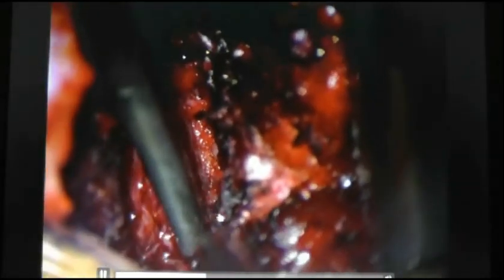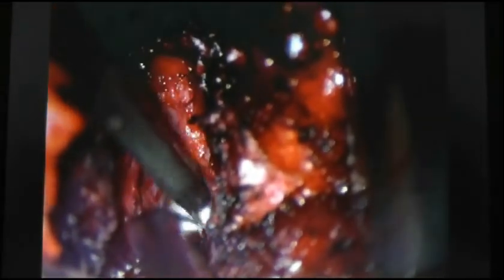In this case, I'm taking away ligamentum flavum. That's why I'm pushing up on the dura with the Kerrison punch, because there's just CSF there. It's not full of neurological tissue like the cervical spine. But this gives you an idea of the technique, what it's like for microscopic surgery. So any questions about that, the microscope?